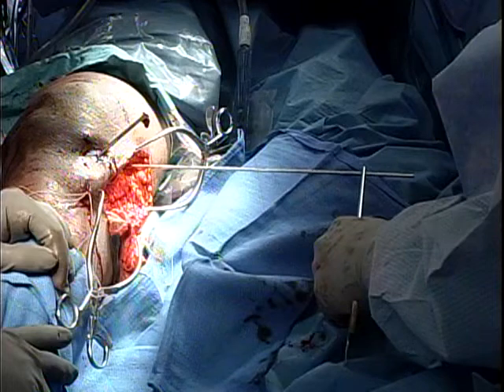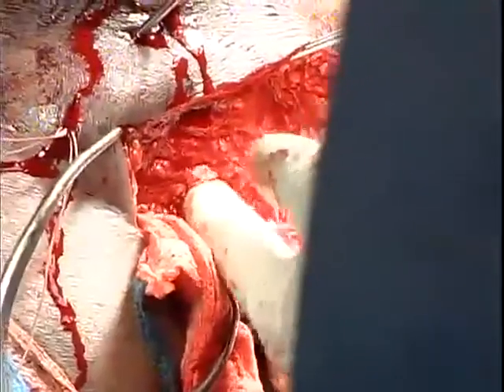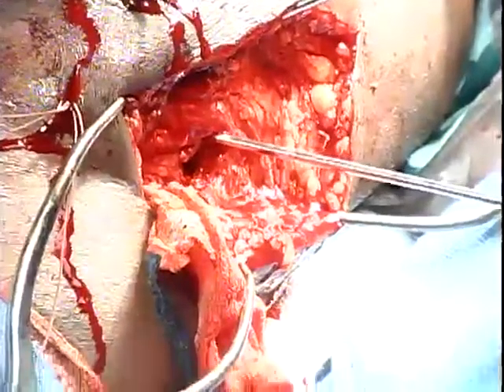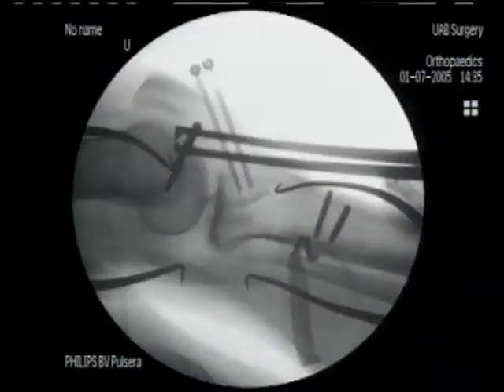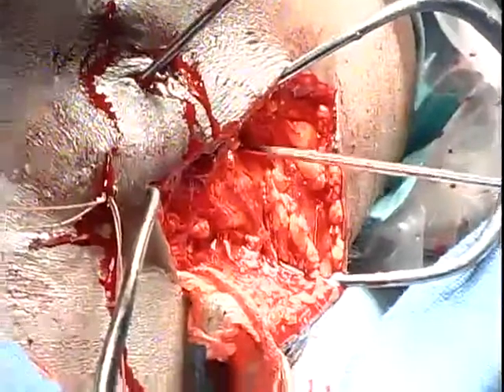Now we find the center of rotation of the knee by drawing a line from the posterior femoral cortex down to where it intersects with Blumensatz line — that is, by definition, the center of rotation. Take the reference wire, held here with a coker, and place the tip at that center of rotation as defined by fluoroscopy, where the posterior cortex intersects Blumensatz line, then begin to tap the posterior portion of the reference wire into place.